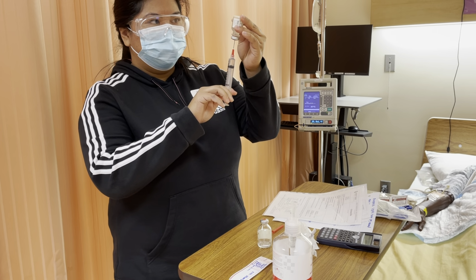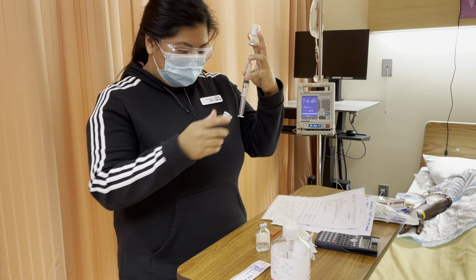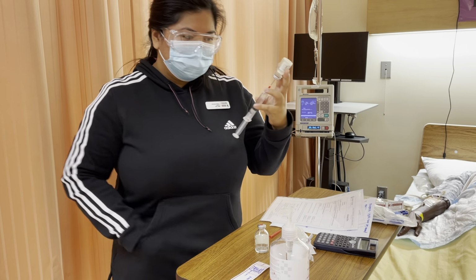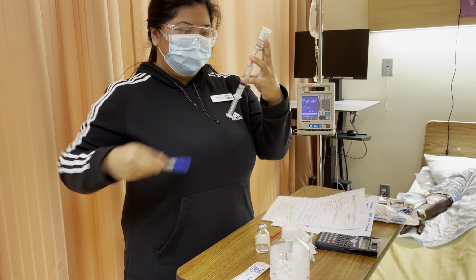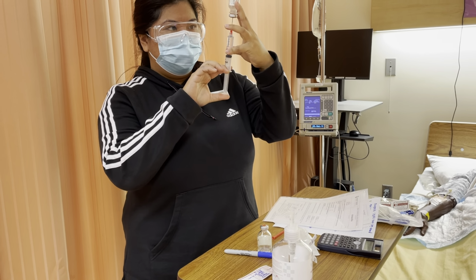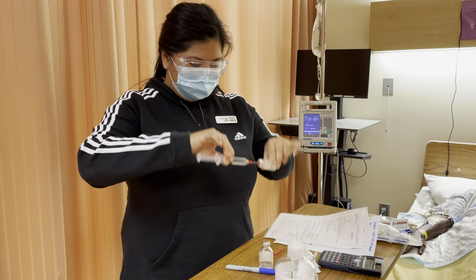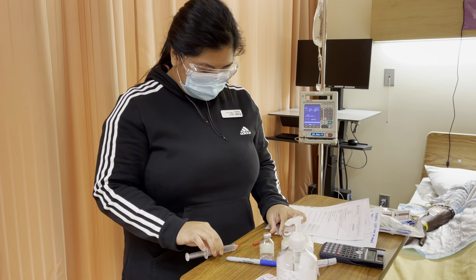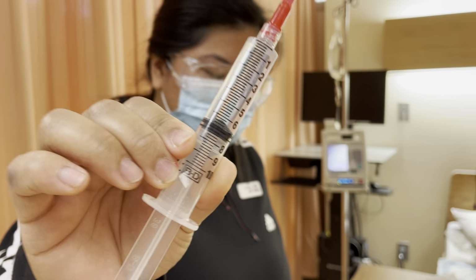And then we're going to withdraw the sterile water. So we need 6.8 ml. I will tap the syringe to get rid of the air bubbles, and then make sure that I have an accurate volume. So you can see that I have 6.8 ml.